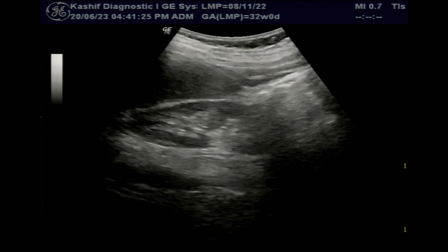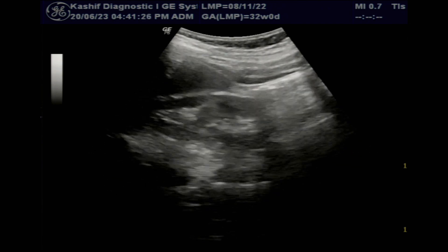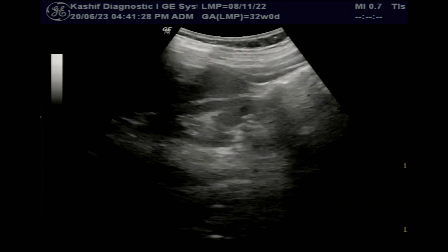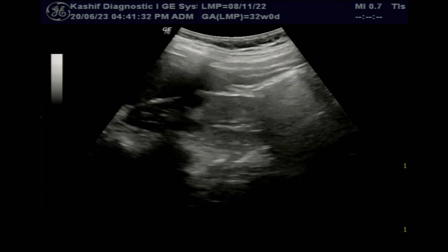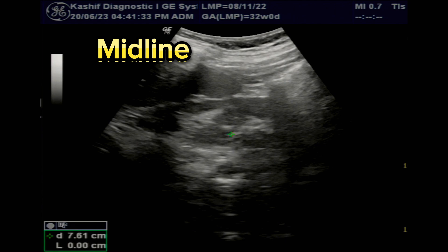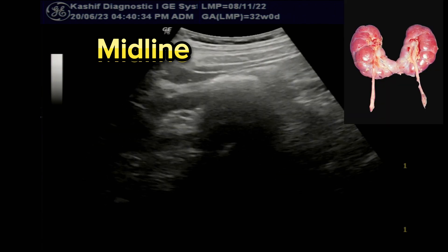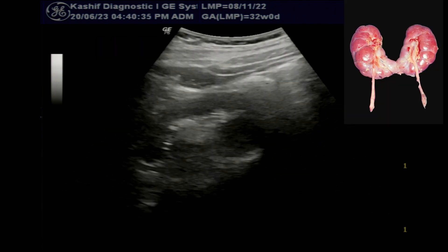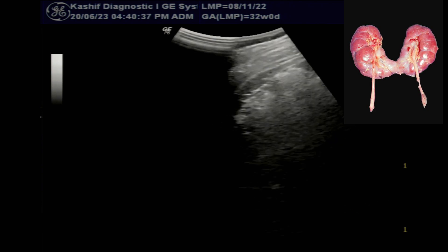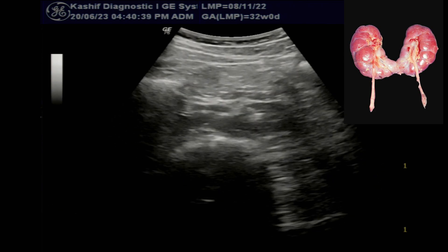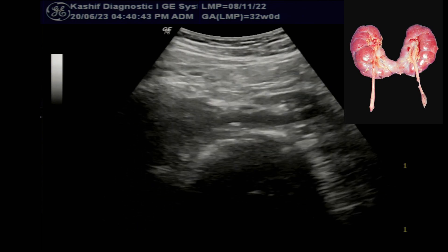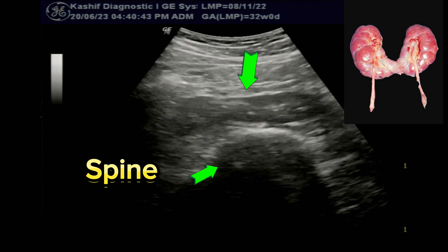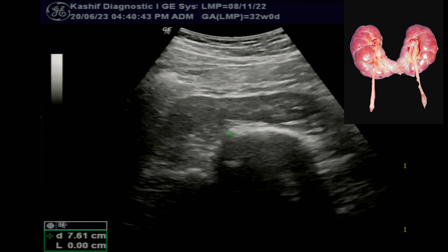But the lower poles are not properly visualized in both kidneys. This is due to malrotation. Move the probe to the midline and try to visualize the lower pole in continuity up to the midline. You can see both of the lower poles are fused together just above the spine.